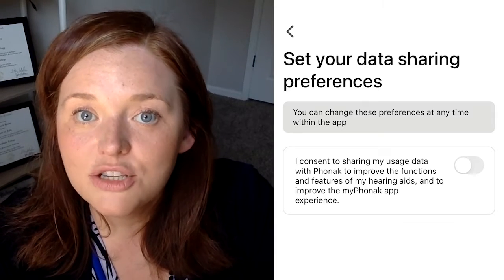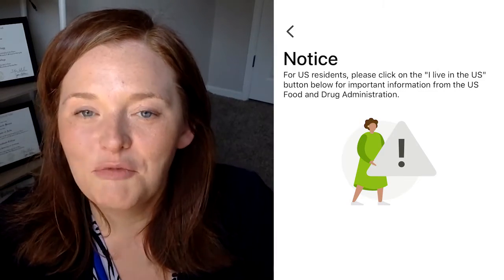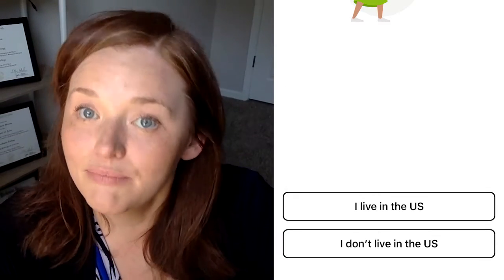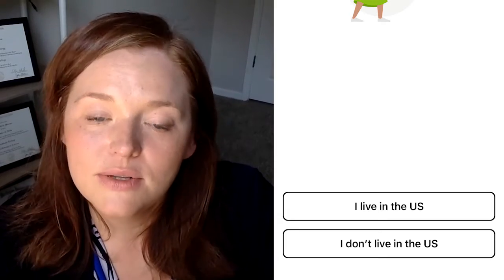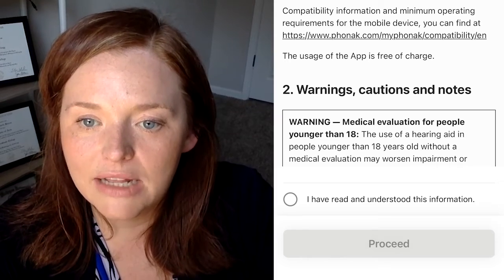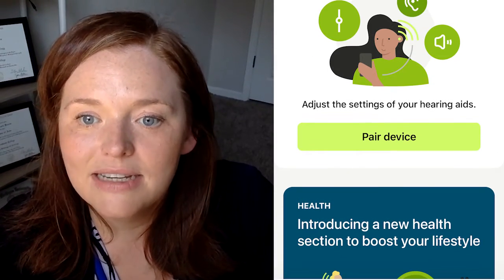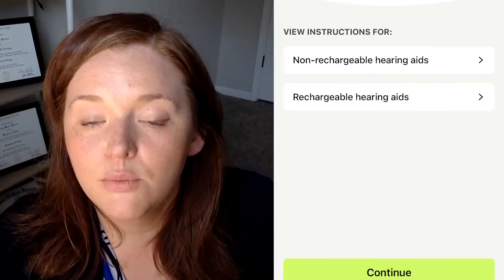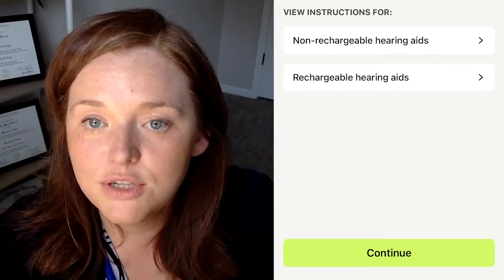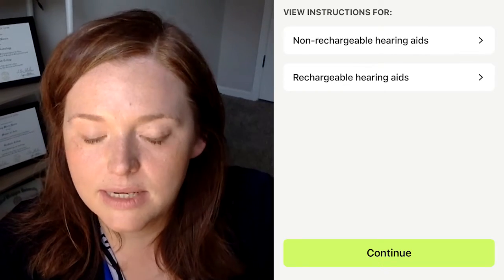After that, you'll get the privacy notice and you'll have to select 'Proceed.' Then on the data sharing preferences screen, select 'Continue.' Depending on where you live — for most of our viewers this will be the US — you'll select 'I live in the US.' After that, you'll confirm you've read the FDA information, scroll down, and under the 'Take Control of Your Hearing Aid' section, select 'Pair Device' and then 'Let's Get Started.' If you have a rechargeable hearing aid, restart them or put them in the charger and pull them out to enter pairing mode. For non-rechargeable hearing aids, open and close the battery doors, then hit 'Continue.'